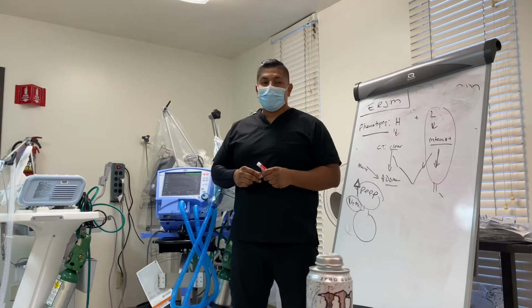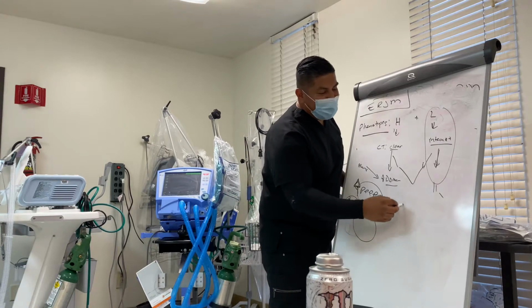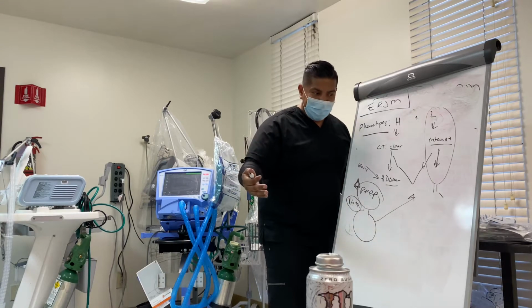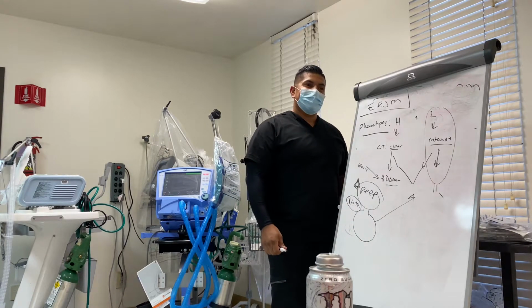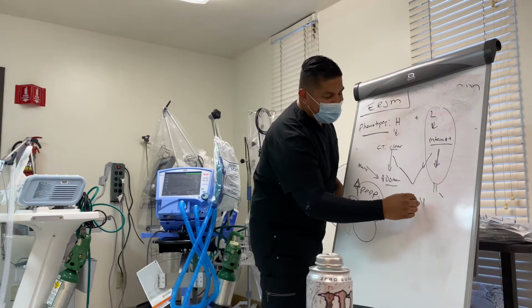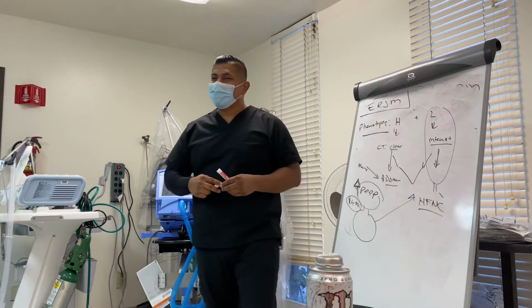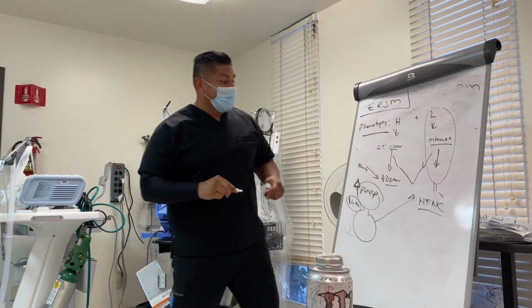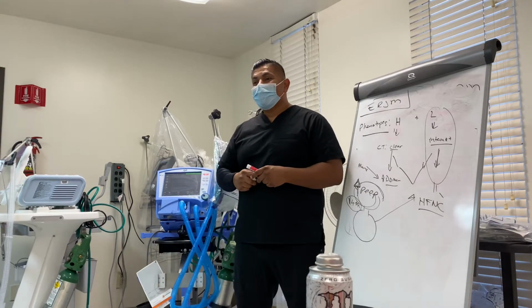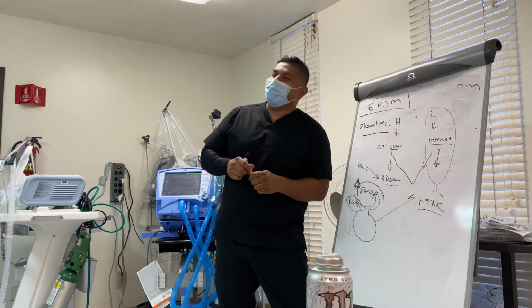Now, how do you do this to a patient that just came in, awake, responsive, but in distress, positive COVID, not intubated? You don't have BiPAP as an option right now. High flow nasal cannula. High flow nasal cannula can provide PEEP to decrease the shearing effect non-invasively. Which is why I moved my stocks over to the high flow nasal cannula.